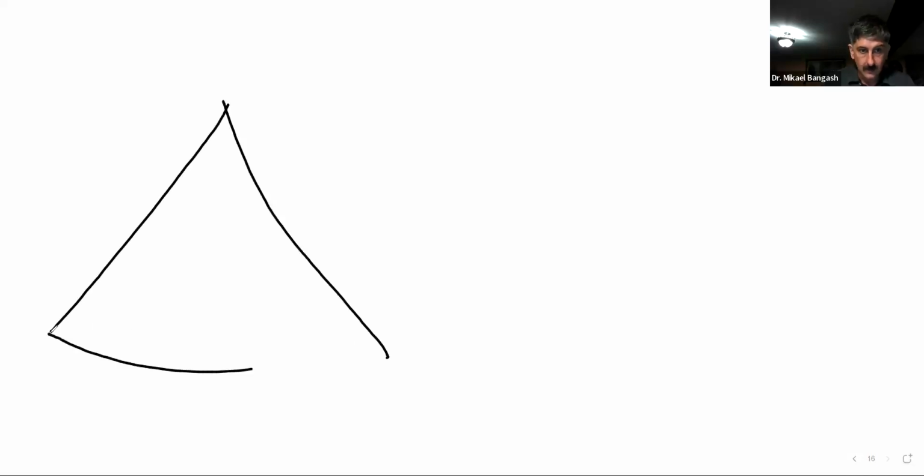Okay, so goals. Here, this doesn't mean your view of depth. You can still have, let's say, an image view of 10 centimeters. But if this is your blood vessel, let's say this is at a depth of 7 centimeters.